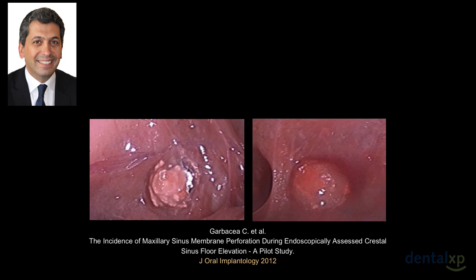Remember that this is a blind technique. We can never know if we perforated the membrane, unless we do radiograph, or unless in some cases we can have a perforation that was not detected, which will lead to an inflammation or infection. So it is very important to be particularly picky when we do this technique in order to avoid this membrane perforation.